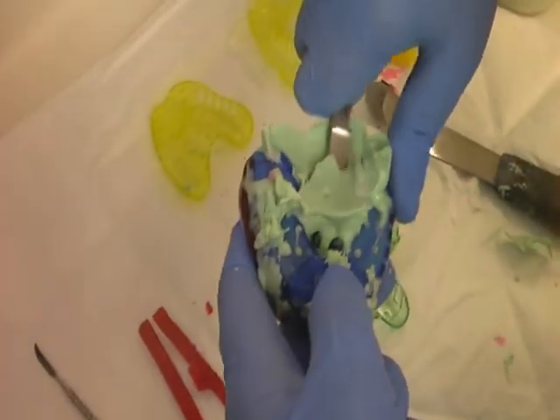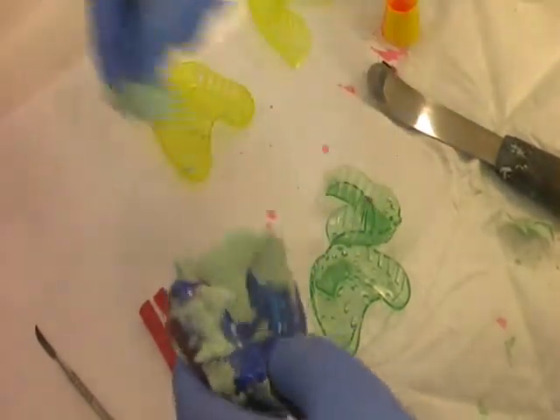Once set, remove the tray and again any excess material should be removed prior to sending the impression to the laboratory.